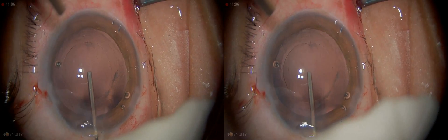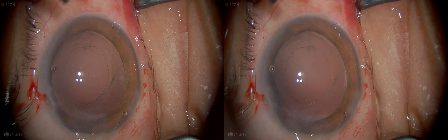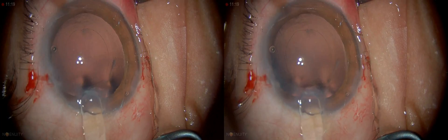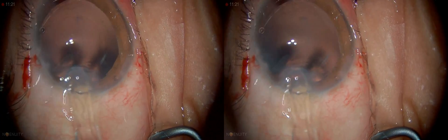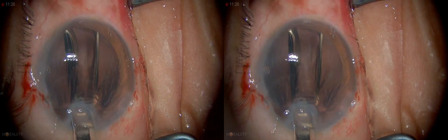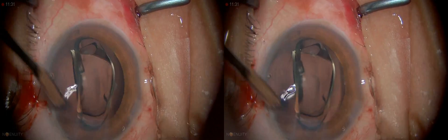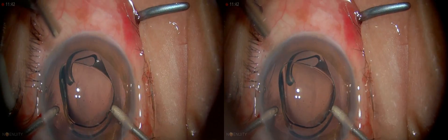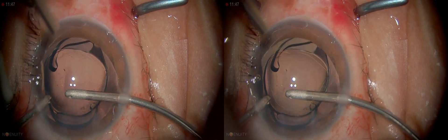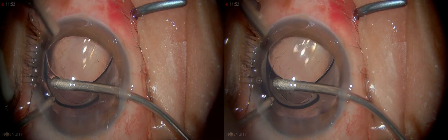Now I'm going to fill the eye with ProVisc. The lens is nicely loaded for me. Just going in, open up the lips and gently inject it downwards so that the leading haptics go into the capsular bag. You can use the bimanual itself to nudge the lens in, and sometimes this method may be necessary.